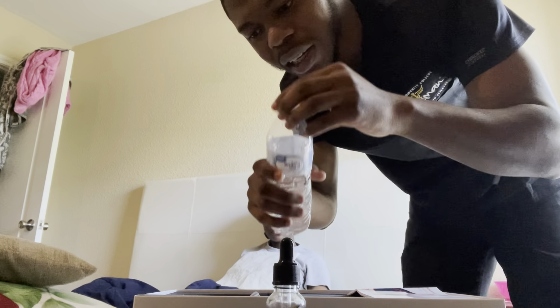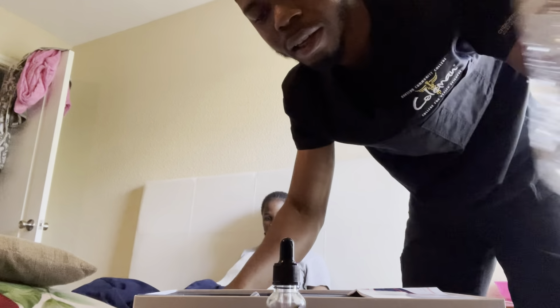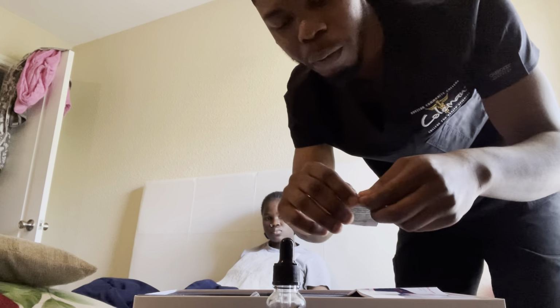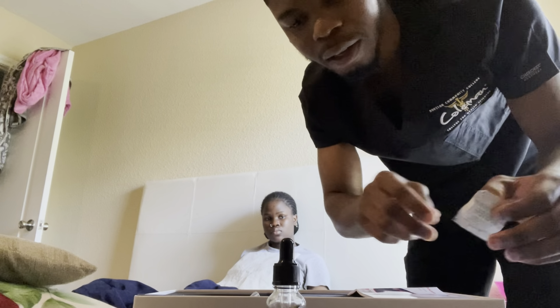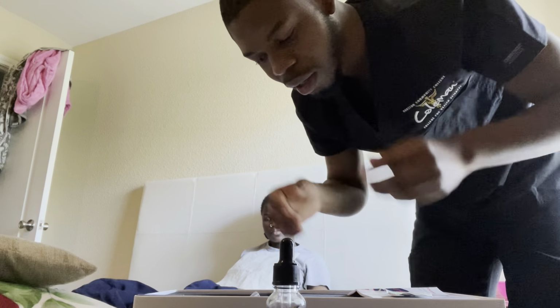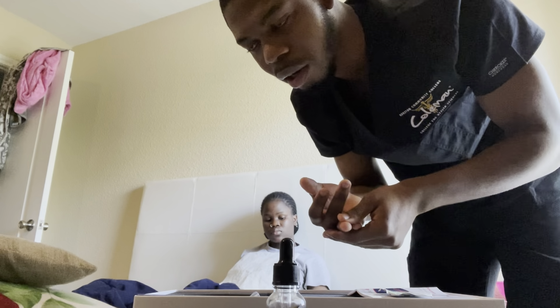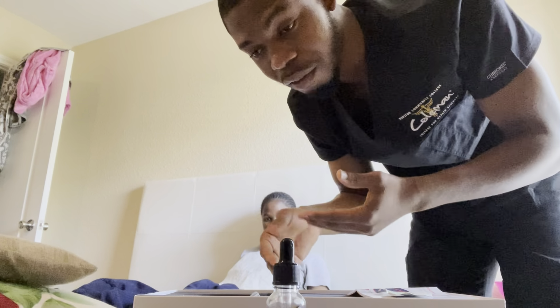I will take my normal saline and I will pour it into the basin compartment of the suctioning kit. I will take my lube, open it and squeeze it on the outer open surface of the suctioning kit. I will put on my gown, my face shield, and my gloves, if there is likely to be splashing.